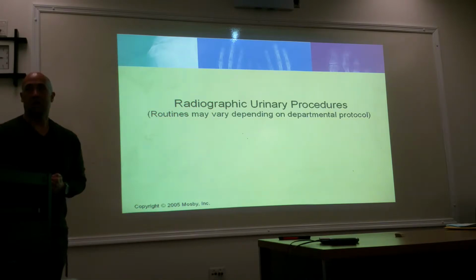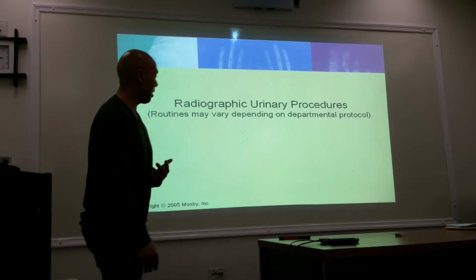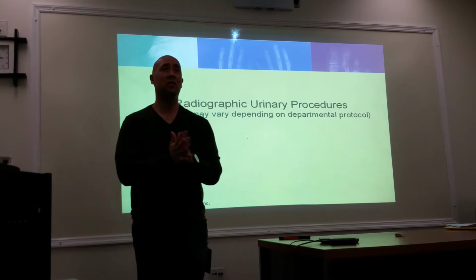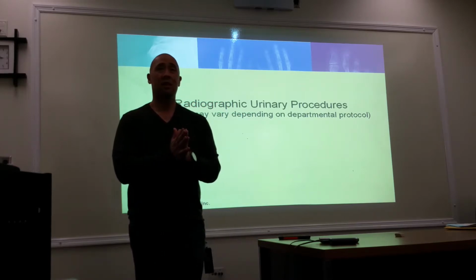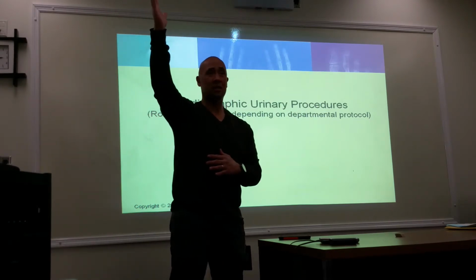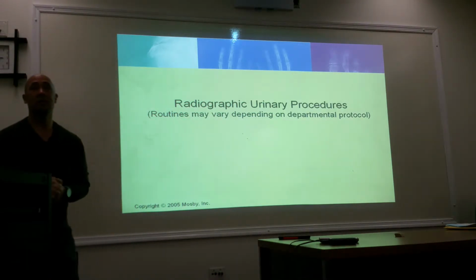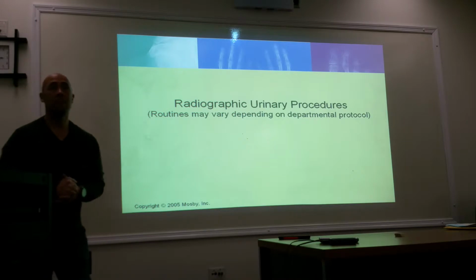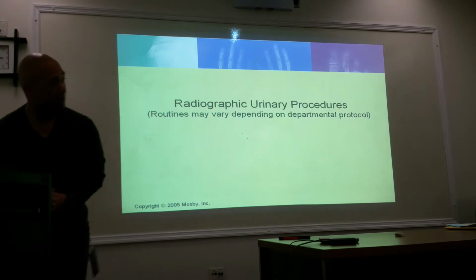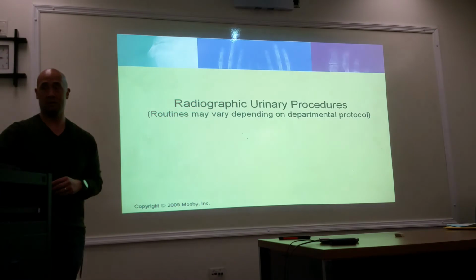Okay. All right, so let's talk about the procedures. Routines may vary depending on departmental protocol. Did you guys talk about tomography? Like the old school way of doing the slices, or actually the two, moving from one into the other. Did Miss Smith discuss that? It's the early days of CT. Before CT, it would take tomographs with the X-ray tube. Okay. All right, so I'm going to have to give you guys a brief rundown on how tomography works.